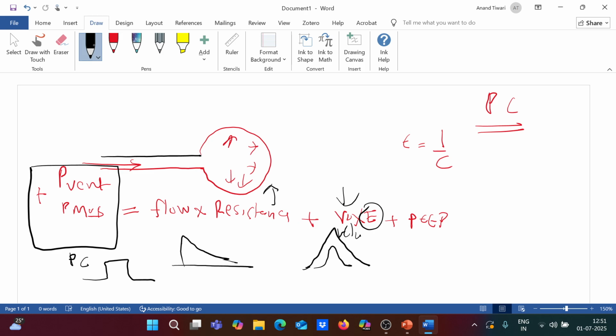In pressure control mode, the left side is under control, so you have to keep a watch on the tidal volume, which may vary in the ICU. We know that a patient goes into fluid overload, or the tidal volume may come down, or if there is a change in resistance, the volume will be variable and there will be desaturation. So in this mode, keep a watch on the tidal volumes.